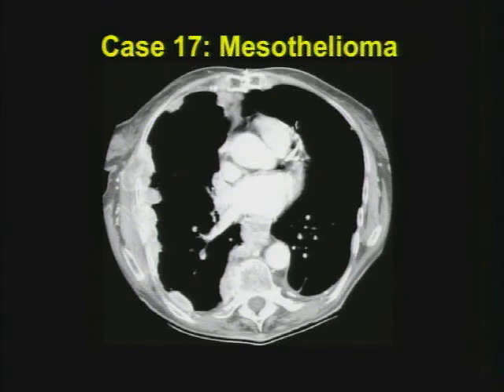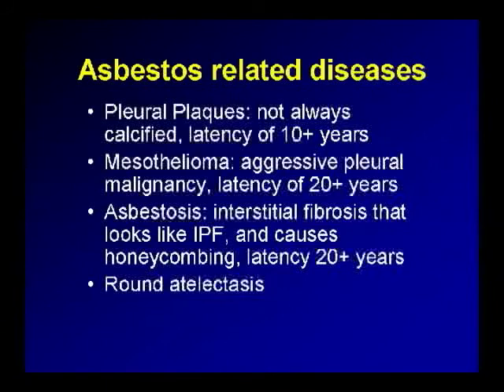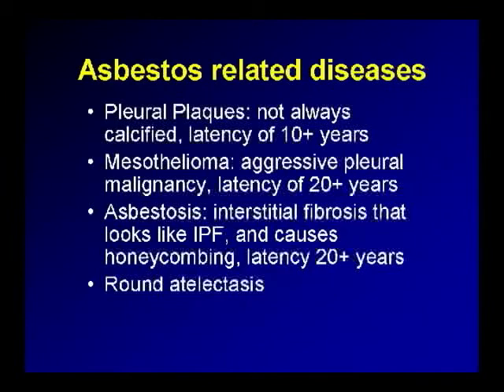Case seventeen: mesothelioma with invasive chest wall mass — not a difficult finding. Note the presence of calcified plaque, suggesting a history of asbestos exposure. The occupations besides working in a shipyard: pipe fitters, people who work in old buildings, people who worked with brake pads in the 60s and 70s, which contained asbestos for heat-absorbing characteristics. A few different types of asbestos-related diseases: pleural plaques — sometimes calcified, sometimes not — have a shorter latency than malignancy. Asbestosis is different from asbestos-related pleural disease — it looks for all the world like interstitial fibrosis, very hard to separate from IPF except with exposure history. Look for honeycombing and calcified plaques. You can also get rounded atelectasis.